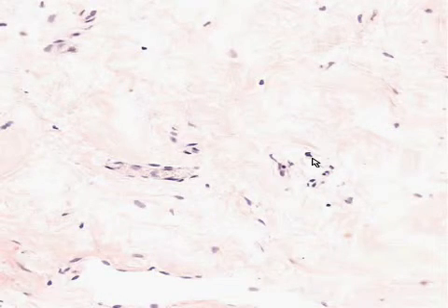Any round cell, like perhaps here, or maybe here, the most likely cell it would be is a lymphocyte, although if you look closely by the usual means, you may find it to be a plasma cell if the nucleus is off to the side, or a macrophage, otherwise known as histiocyte, if there appears to be a lot of granular or darkened cytoplasm clustering around the nucleus.